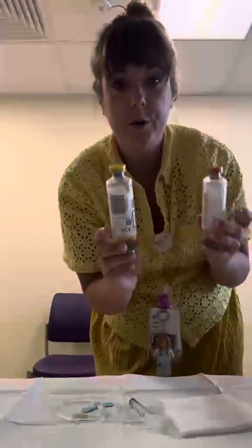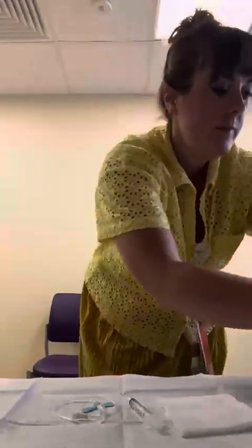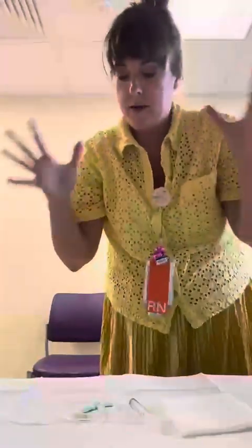And then if they order both, you're going to be collecting both. So you're going to get a helper. That's all part of this huddle discussion, is who is going to be doing what. Always do this with a second person, sometimes even a third, but the minimum is 2 people. So never do this alone. You need the second person not only to help maintain your sterility, but to also help comfort the patient. Sometimes we forget the niceties of making sure the baby's calm. So if it's appropriate, sweeties, pacifier, swaddling, containment, shushing, music, whatever you can do to create a calm environment as we're doing something kind of painful for the babies.